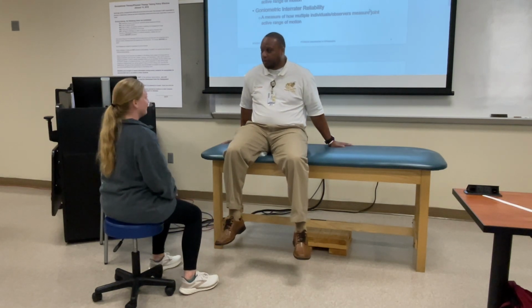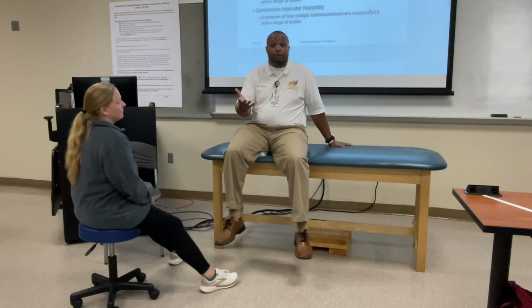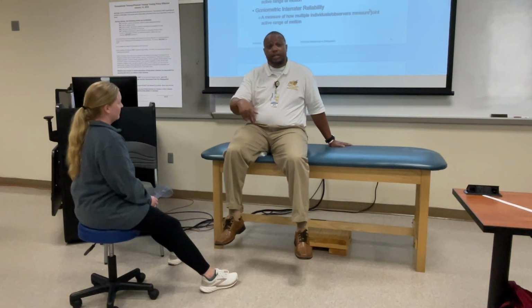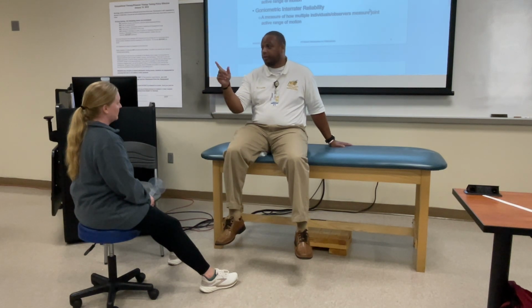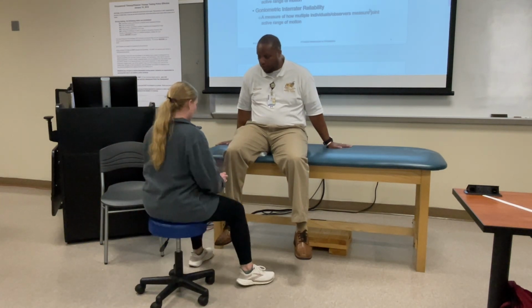All right. So now, there are different reasons range of motions could be different. That's in the presentation, right? This is a reason why her range of motion measurements could be different than Emery's. Because with Emory, I didn't have the towel to put my hip at 90 degrees. So that could cause a difference. We're gonna see, we don't know. All right, hip external range of motion 3 times.